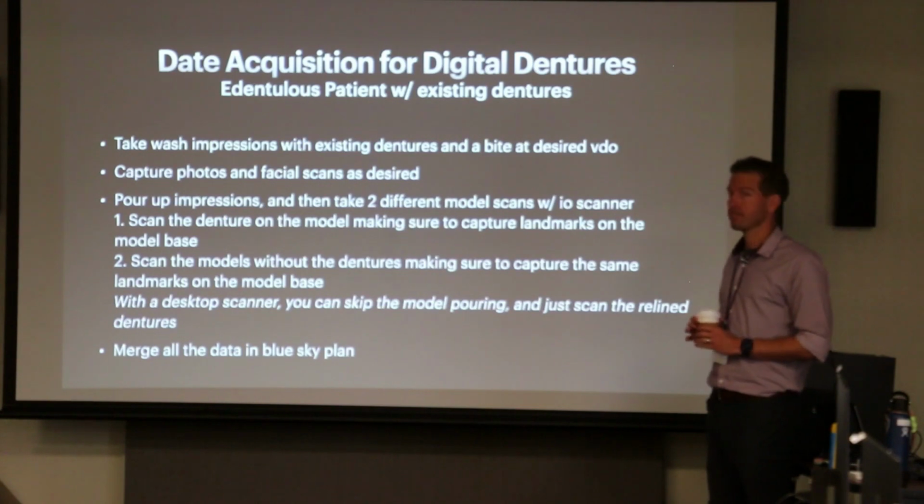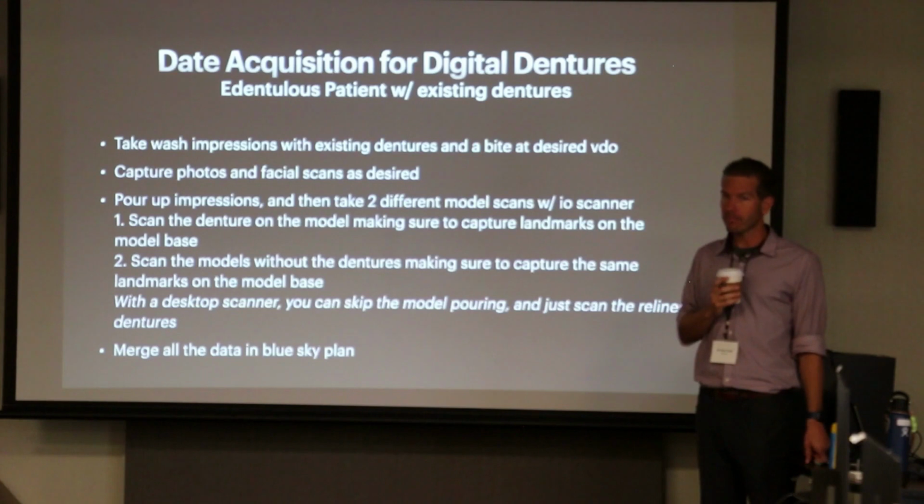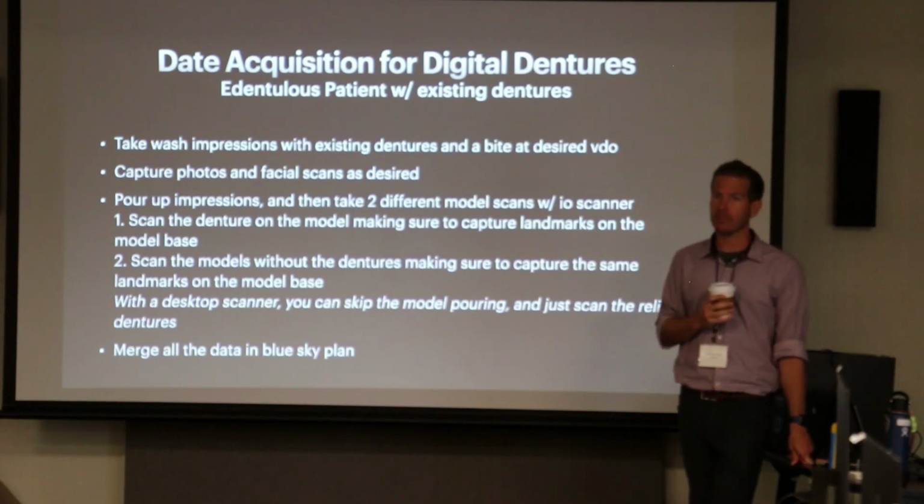Can I ask you a question? Yeah. You talked about you're not capturing a lot of the vestibule. When you use the word wash, are you doing heavy body border movements? You're adding to the border potentially, right? Mm-hmm. And then you're doing more of a light wash internally after that? That's different from the way I was talking. Yeah, I was going to say there's a lot of different schools of thought on doing it.